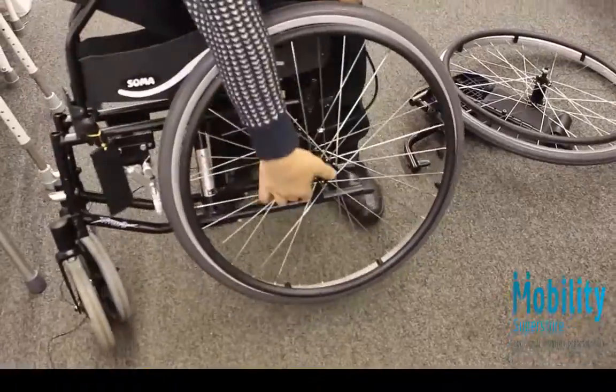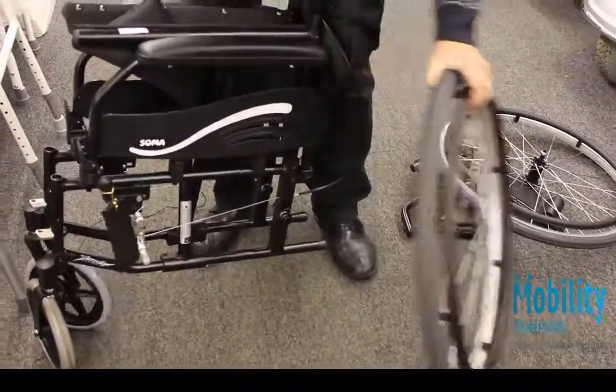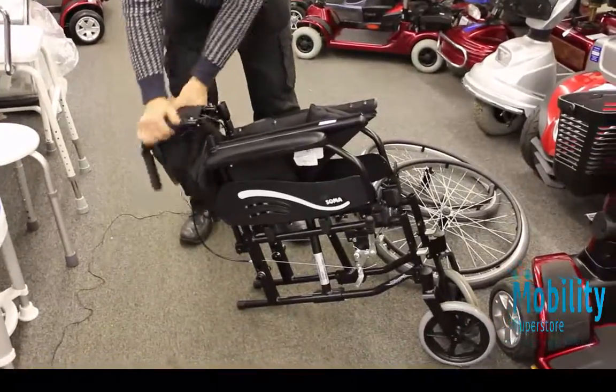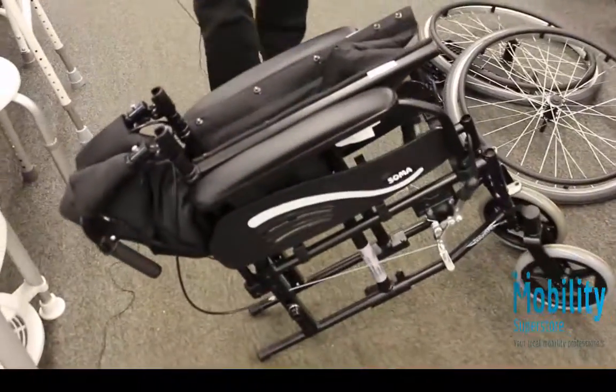Just hold it up, press the button on this wheel and that one comes off, so you're left with the carcass of the chair. You can then push these two levers and that's the collapsed size of the chair.